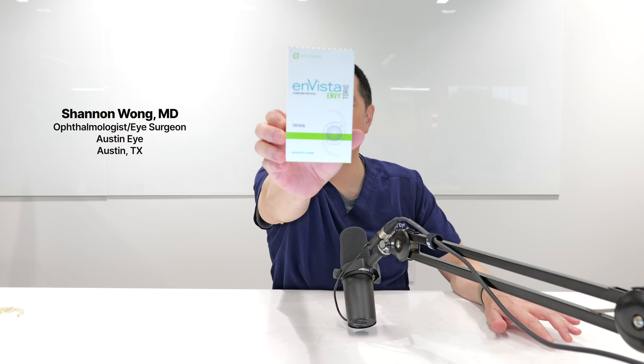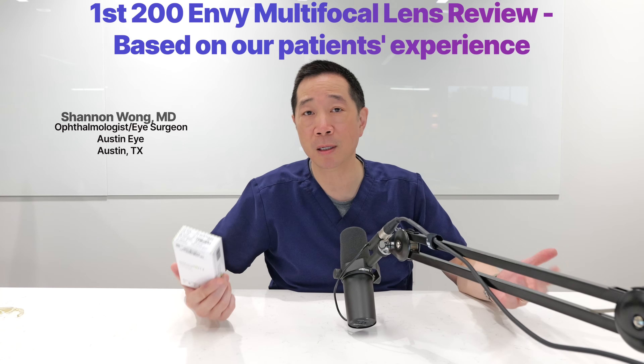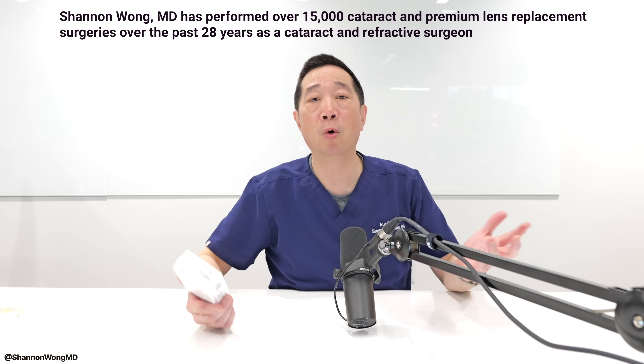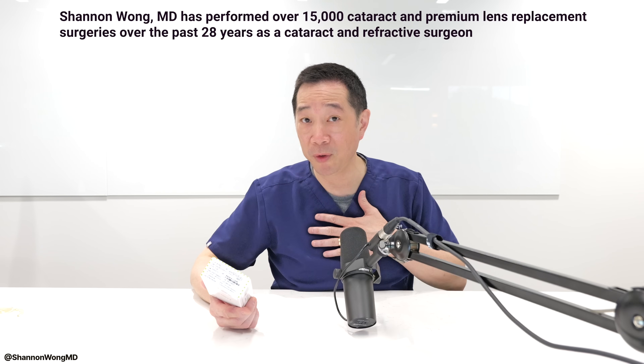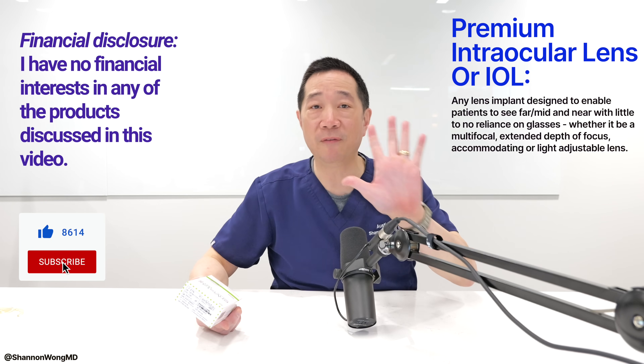This is the Envy Multifocal Intraocular Lens, or IOL. Over the past seven months, I used 201 of these Envy Multifocal Lenses for patients who came to see me for premium cataract surgery or premium lens replacement. In this video, I'm going to give my review of how well this lens works. We're going to talk about five things.